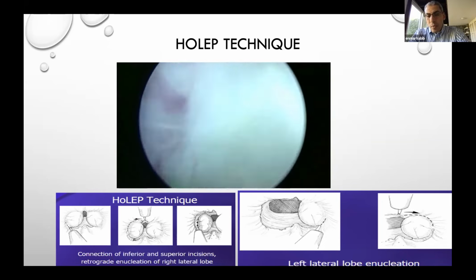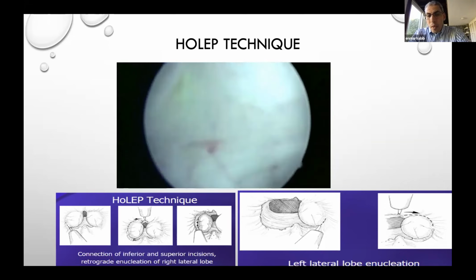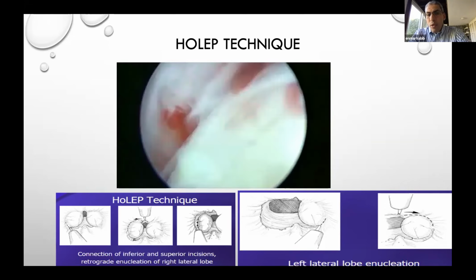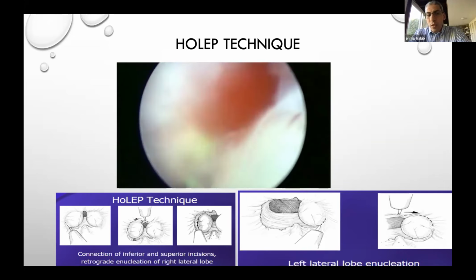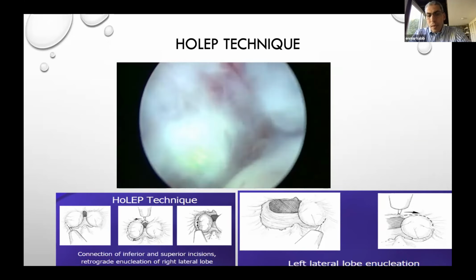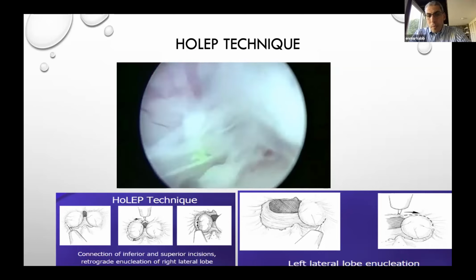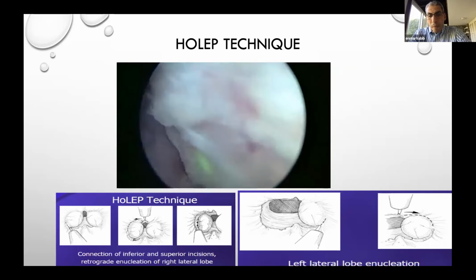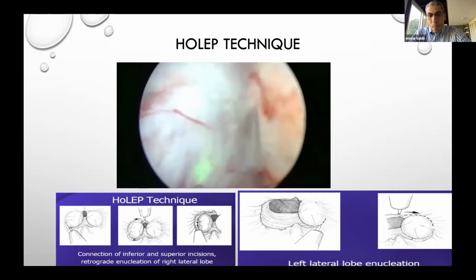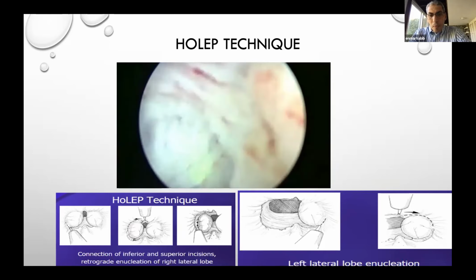Now the anterior commissure is just below me, so I am passing to the other side, to the second lobe. Now I am here at the 1 o'clock incision, 1 o'clock position. You have to keep the adenoma under tension all the time, so it helps you to see where the line is to place your fiber for separation.